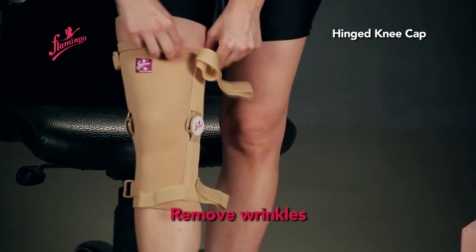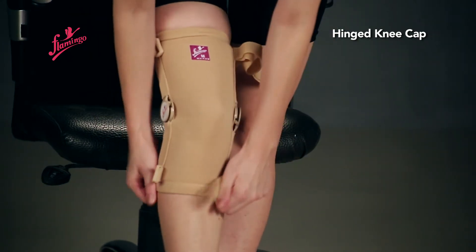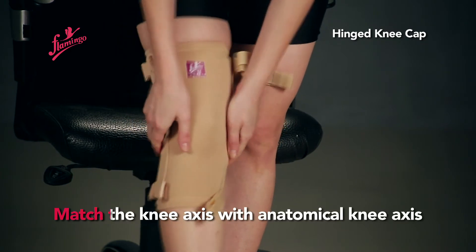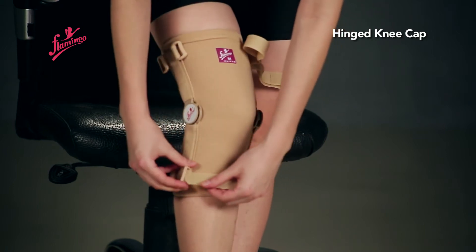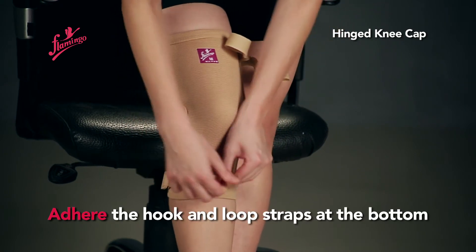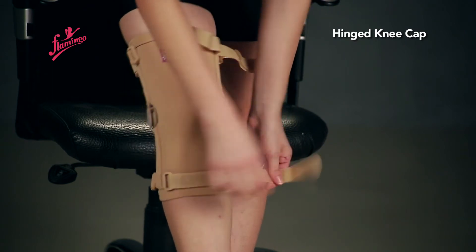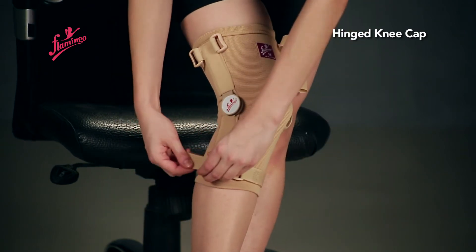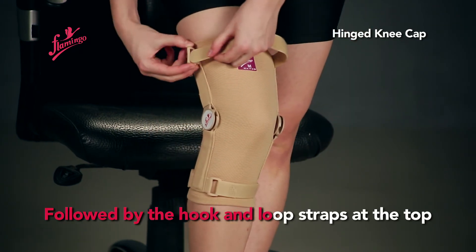Remove any wrinkles. Match the knee axis with the anatomical knee axis. Then adhere the hook and loop straps at the bottom, followed by the hook and loop straps at the top.